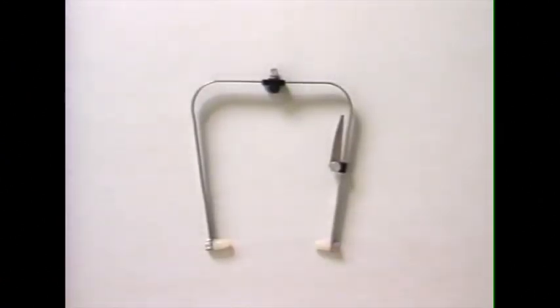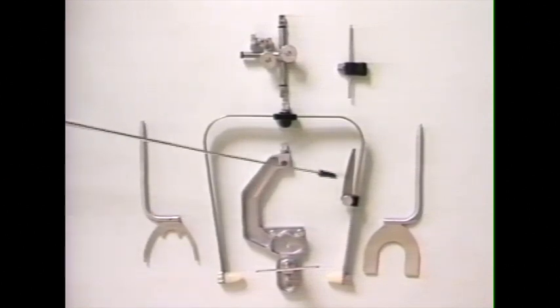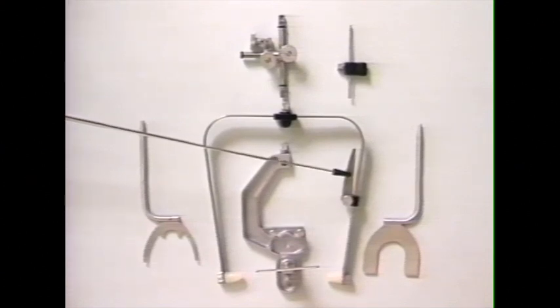The Hanau Springbow is a self-centering ear bow. It allows the dentist to rapidly and easily obtain a Facebow record and transfer it to the articulator. It can also be steam sterilized in an autoclave. It consists of the spring bow itself, which is an ear bow which springs in and outward to allow placement into the ears. The ear bow also has an axis orbital indicator on it, which allows the vertical orientation of the Facebow.